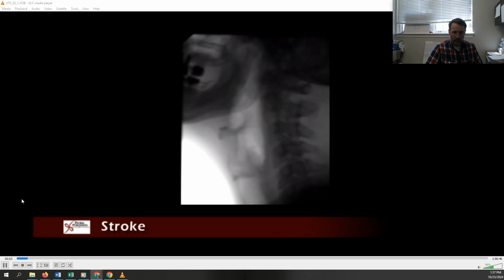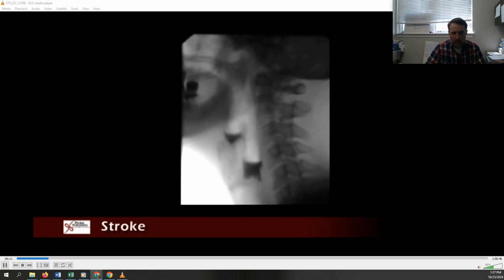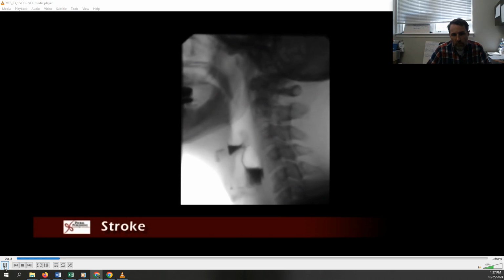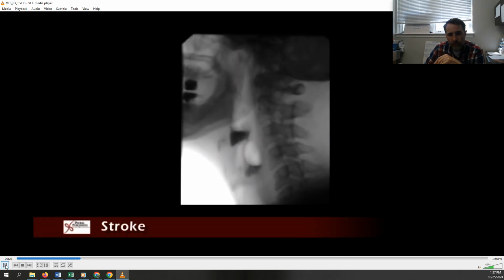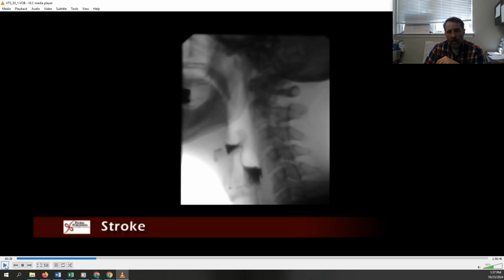A 68-year-old man in good health presents with a sudden onset of dysphagia. He reports not being able to initiate a swallow and difficulty swallowing his secretions. Clinically, his voice is wet dysphonic. On test swallows, there is considerable labor in initiating a swallow. All right, so what we're looking at here. Movement on laryngeal palpation. A video fluoroscopic assessment of swallowing is performed.